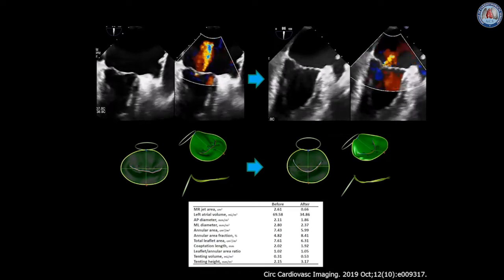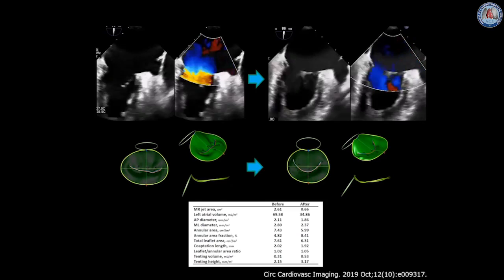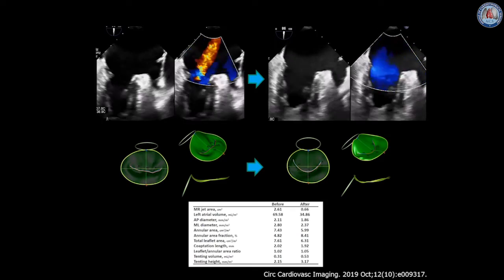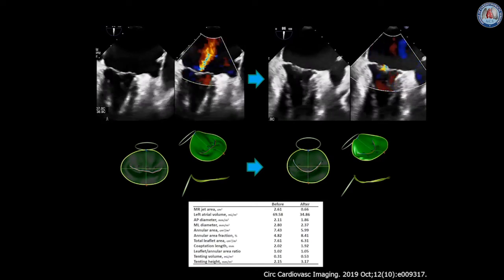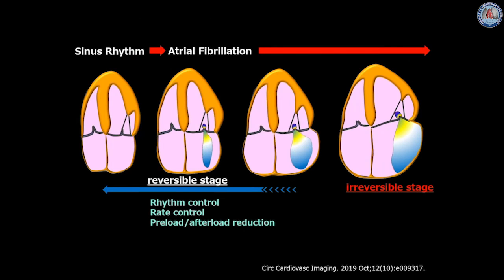These results show the positive effect of radiofrequency catheter ablation on the 3D mitral valve apparatus, with reduced degree of atrial MR. Early intervention by catheter ablation can prevent progressive mitral valve complex remodeling and thus severe atrial MR at a later stage of the disease.